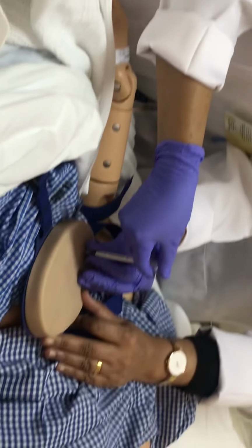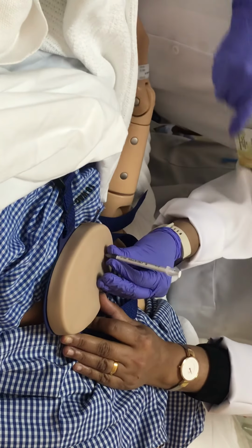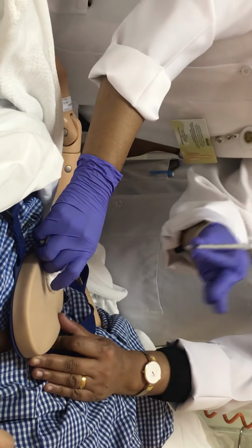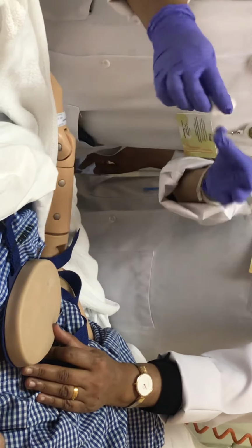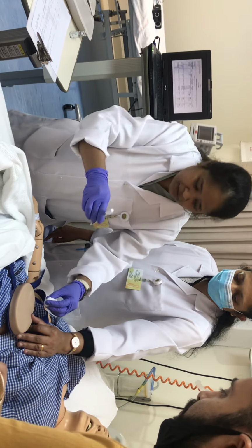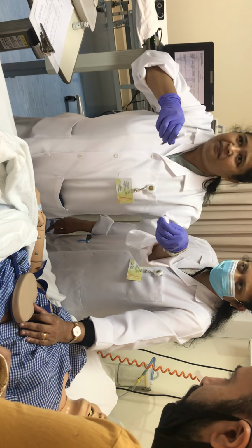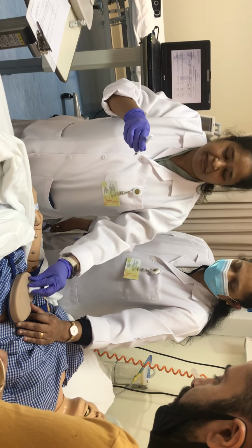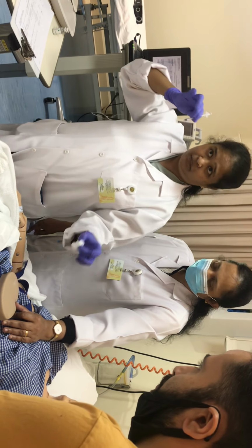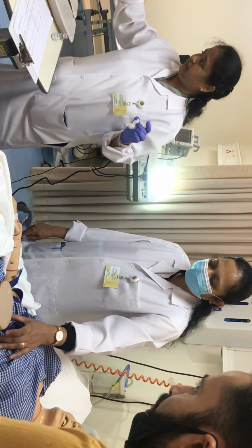Okay, after you give, you need to wait for 1, 2, 3, 4, 5. Your cotton should be there so that you are just removing. Cotton is not for cleaning or not for pushing the medicine or anything. See, when you are pulling it out, the skin is also coming, just to prevent that and reduce pain. That's all. So remember, they should keep it, then remove it. Okay, immediately they should throw it.